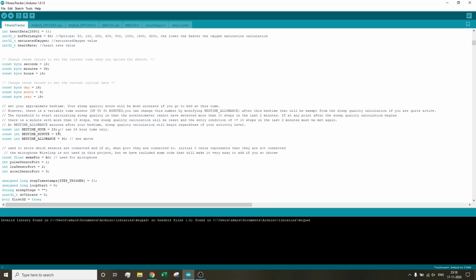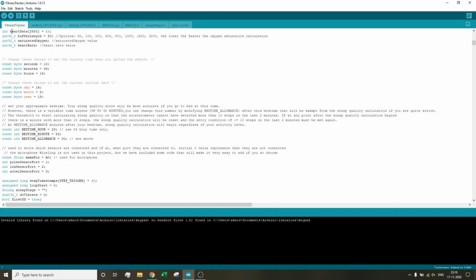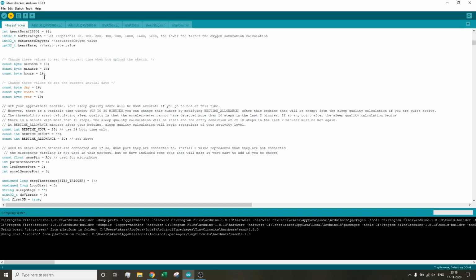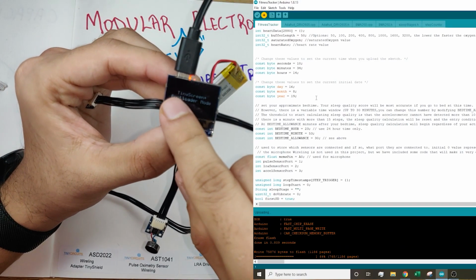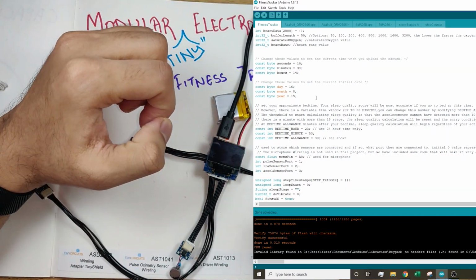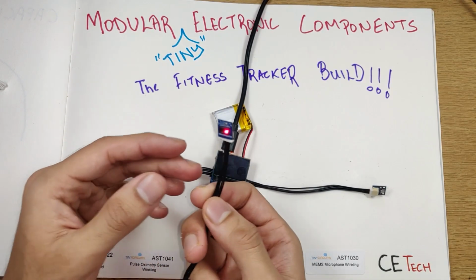There it is. Once you have that open in the Arduino IDE, now we can go ahead and select in the tools the correct COM port. It shows as COM4, which is Tiny Screen Plus, and then we can directly hit the upload button. You can change some parameters over here, like the date, time. While the code gets uploaded, it says Tiny Screen Plus bootloader mode. Once that goes off and we see that it's done compiling, we can move back to our fitness tracker.